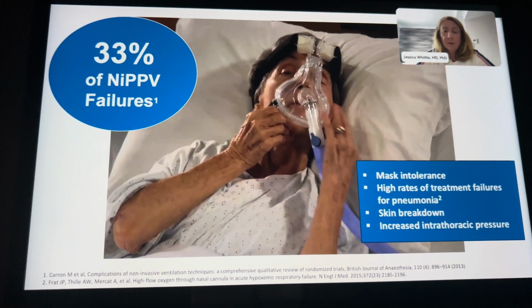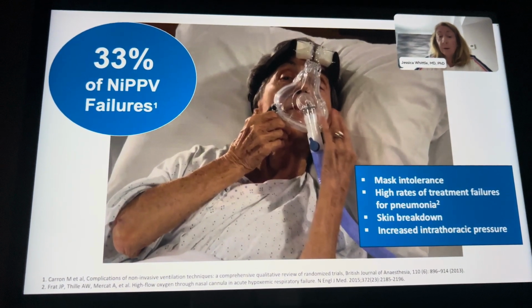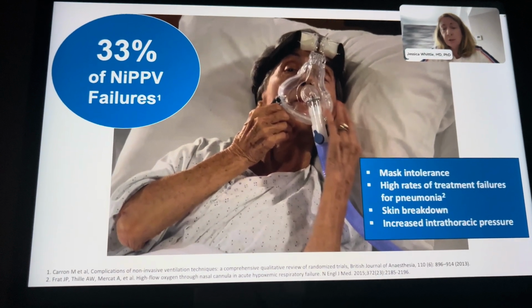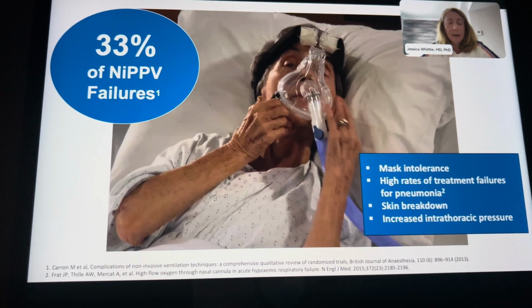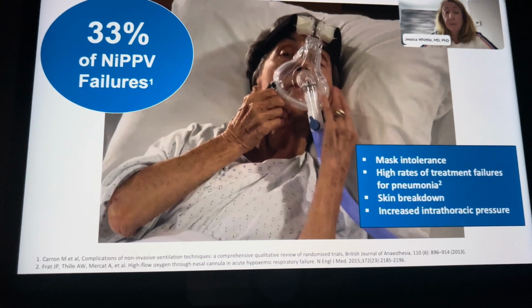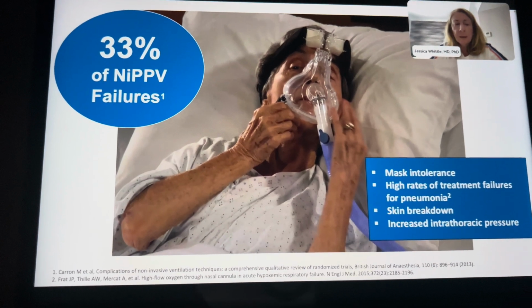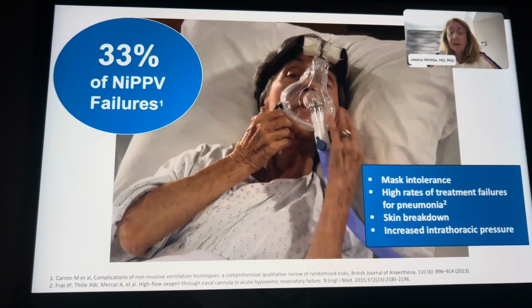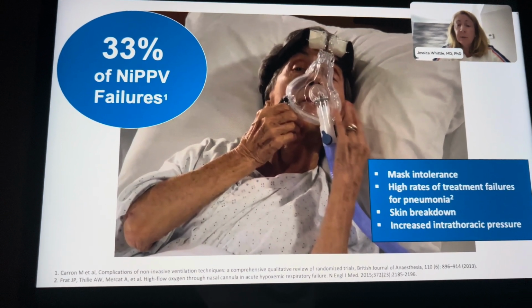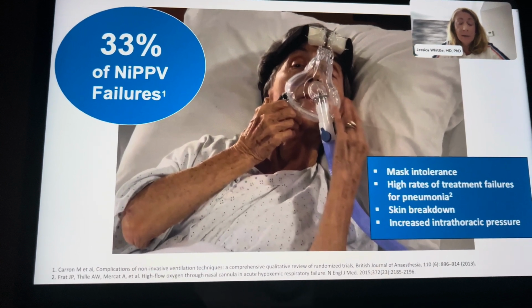That then led to this trial where we said, if you have some patients, BiPAP works quite well when you're able to do it, especially if you're able to do it correctly. But it's so frequently challenged by patients who cannot tolerate the mask or patients who over time need to be able to eat and drink, all the things we discussed. And so this 1/3 of patients from our previous study were very interesting, and we decided to go ahead and say, let's do a randomized controlled trial looking at only type 2 respiratory distress patients. And that's what led to the study we're talking about today.